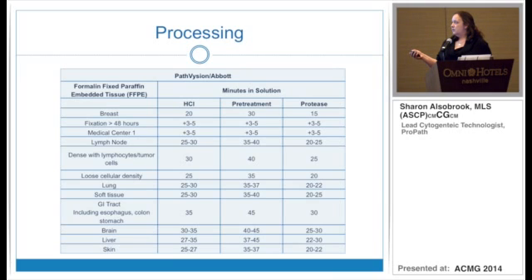then based on these variations in tissue type or a particular place that you're going to get tissues from, that also plays in, because they swear they fix it the same way everyone else does, and for whatever reason theirs always performs differently. You got to take them at their word, I guess. But this system is what we came up with.